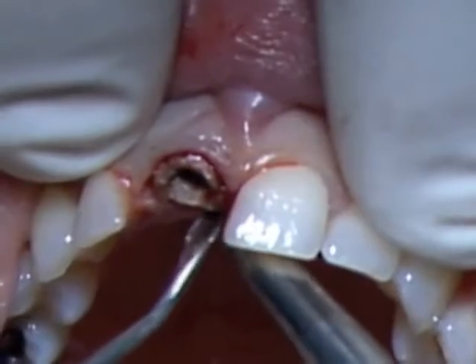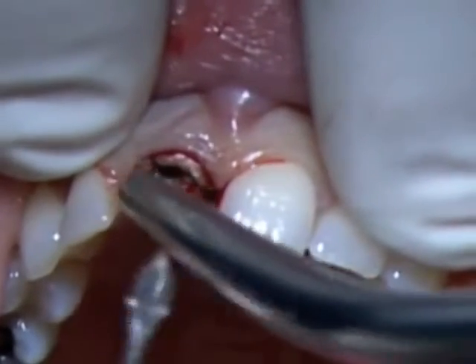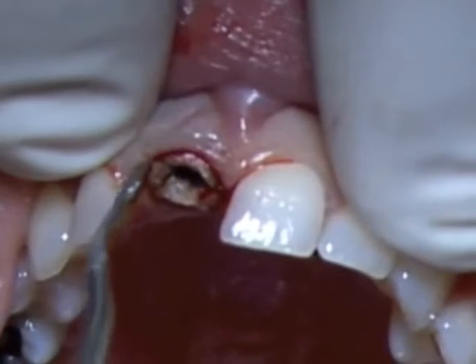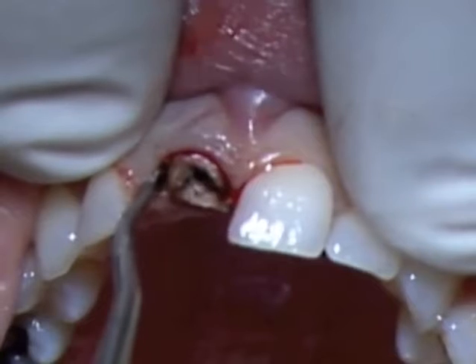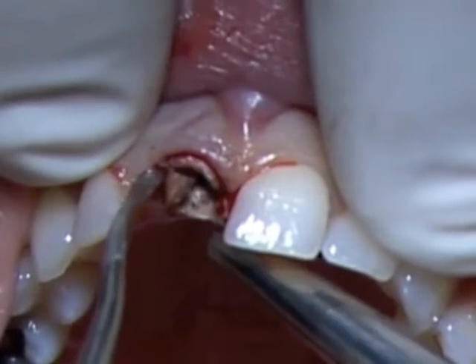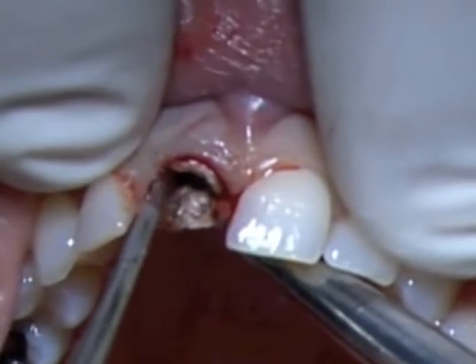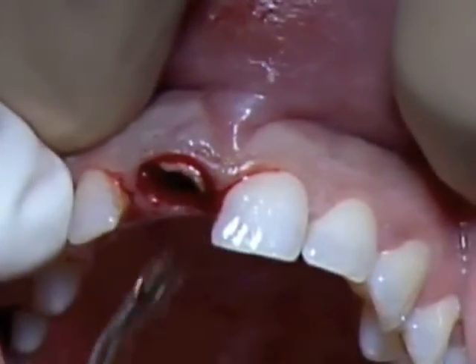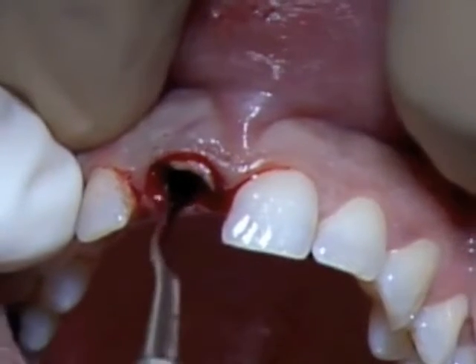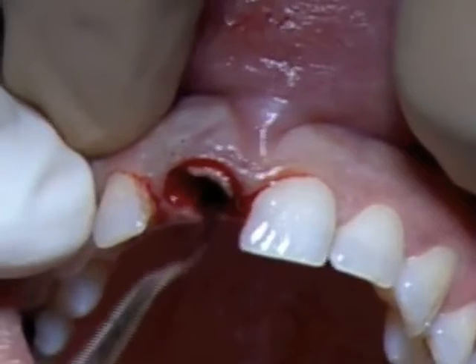We'll see here how deep it can go, and we will extract the palatal part of the root. You see here, without injuring the papillas. We will continue by extracting some additional fragments of the palatal part of the root.